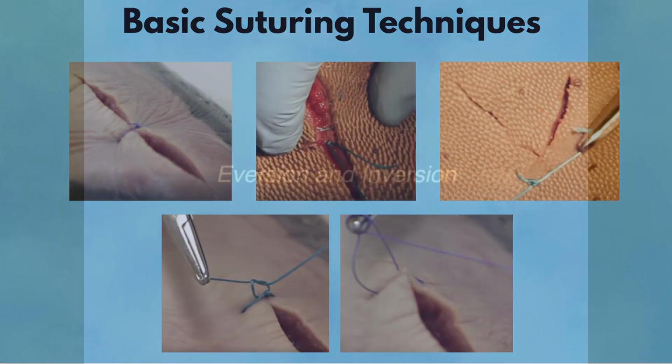First, we will review one of the highest yield fundamentals in suturing. Whether a wound edge ends up flat, everted, or inverted is not luck. It is geometry. The final edge position is determined by the angle the needle travels through the tissue relative to the tissue surface. That angle comes from two things the surgeon controls: how much the edge is lifted or everted with forceps, and how much the wrist rotates to follow the curve of the needle on the way in and on the way out. Think of the needle as a small, curved wheel. It should roll through the tissue along its arc.